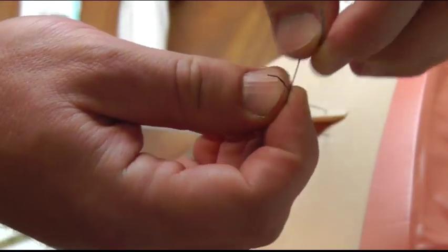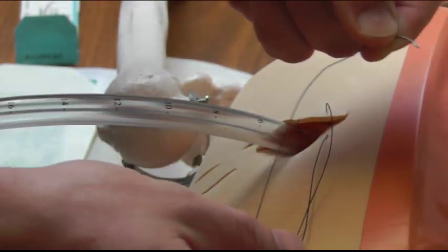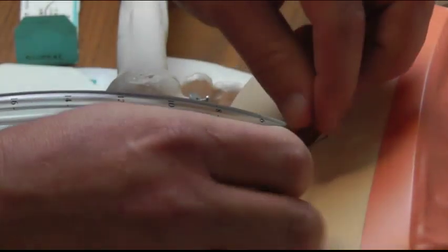It doesn't have to be exact, just rough. If you think you're not going to accidentally pull the stitch out, now's not a bad time to actually cut the needle off, so you don't stab yourself with it.